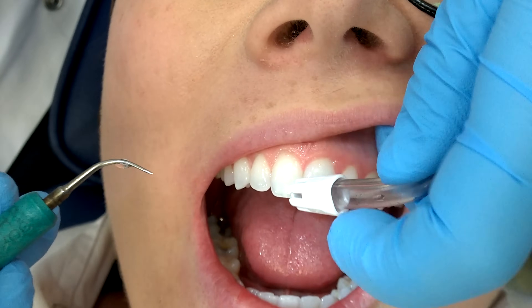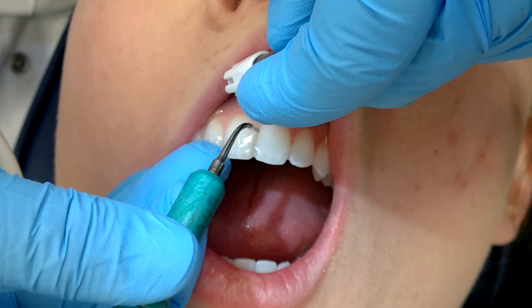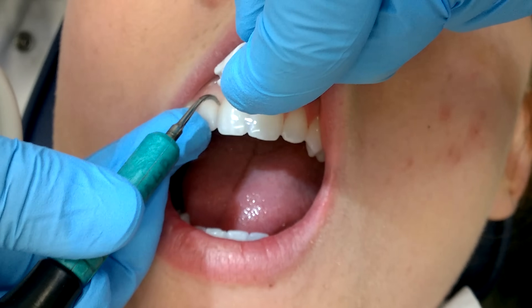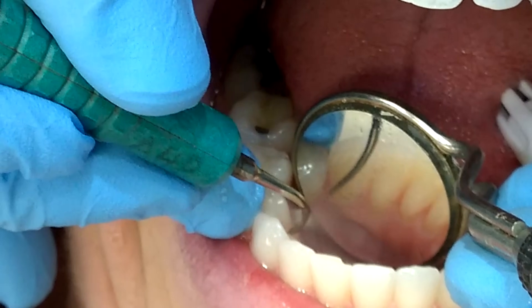To prevent the water from going up the patient's nose, you can place the suction with your hand blocking the area as I'm showing here. Sometimes I'll even hang the suction on the cheek and retract the lip with a paper towel that will kind of cover the face as well.